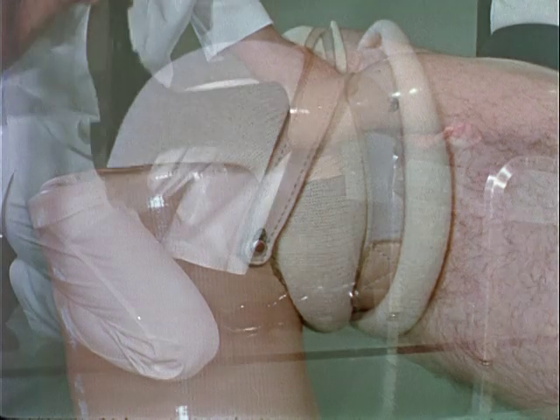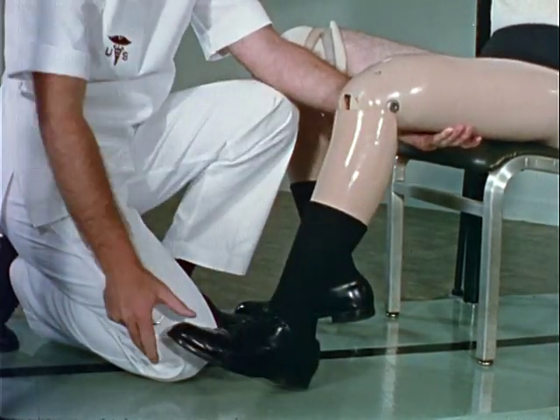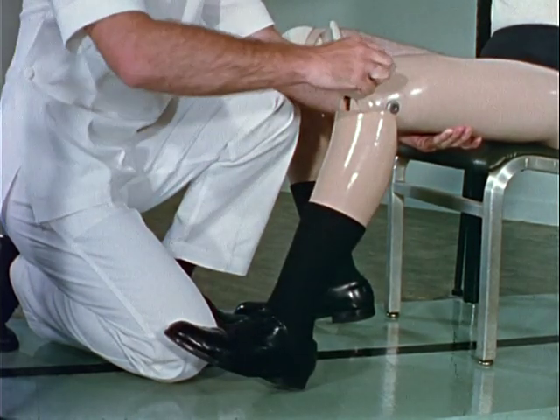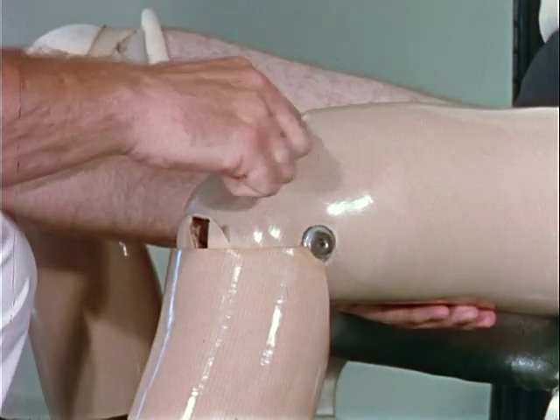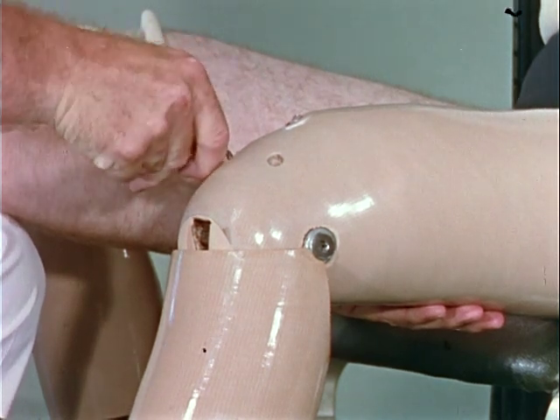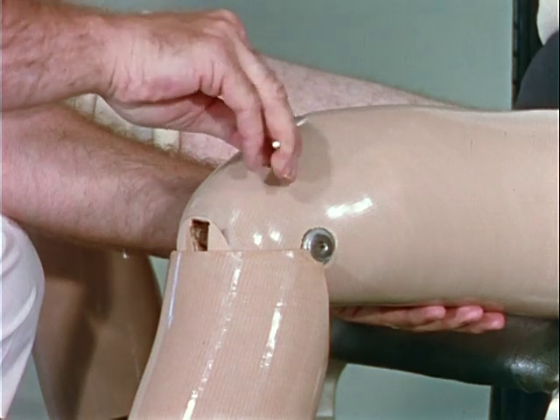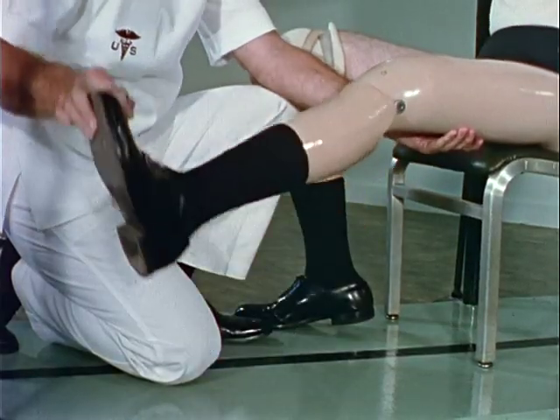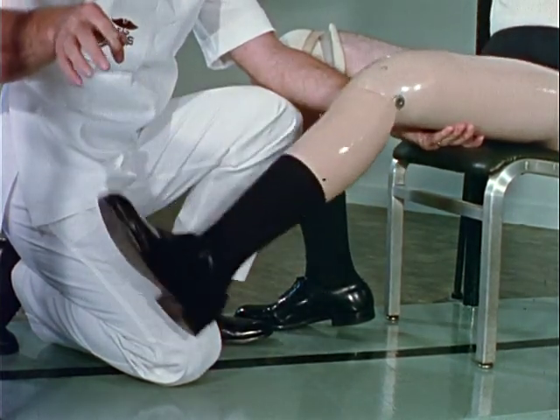The constant friction of this knee unit is inadequate because it permits excessive freedom of the knee. The mechanical friction of the knee unit is constant but adjustable. The friction may be increased or decreased by adjustment with an Allen wrench. Adequate friction is essential for knee stability in the stance phase and proper timing in the swing phase.